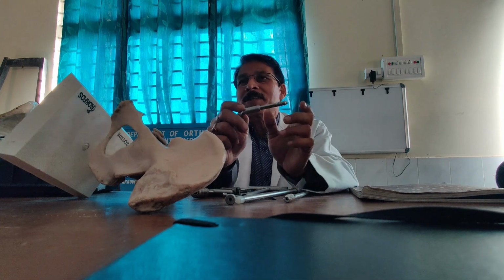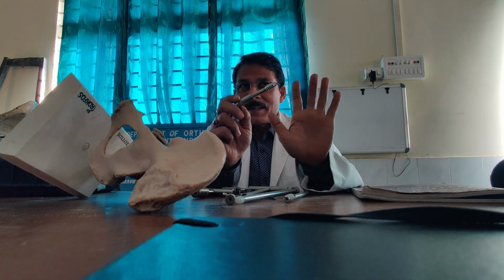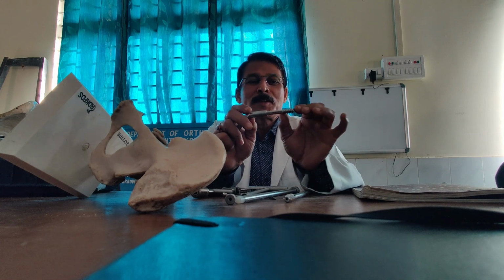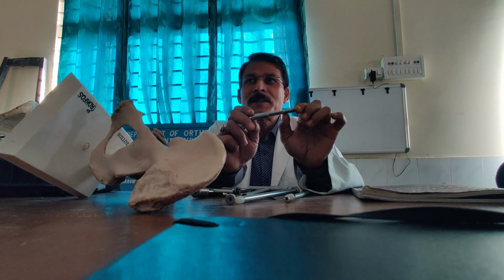So calculate yourself. Now what is the size of the barrel? Is this point clear to all? This is a very important thing because you have to understand the mechanics, otherwise it is not going to serve the purpose. So certain parts should be inside, certain parts should be left free, certain parts should be threaded inside.